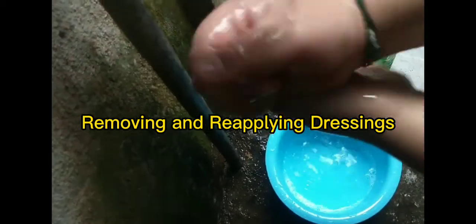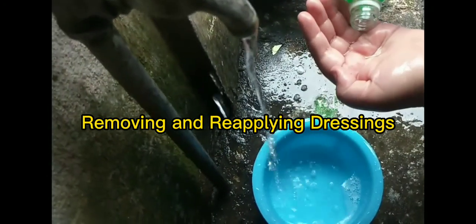If an order has been obtained and a dressing is to be removed for a procedure, the radiographer must be able to remove it without contaminating the wound or himself in the process. First, wash hands as for medical aseptic procedure.